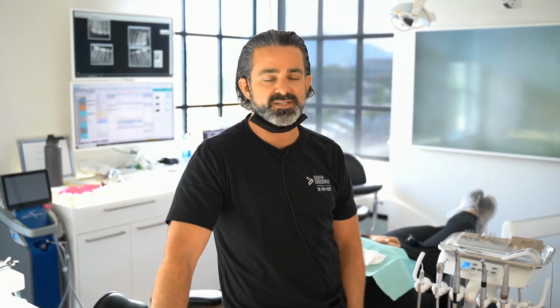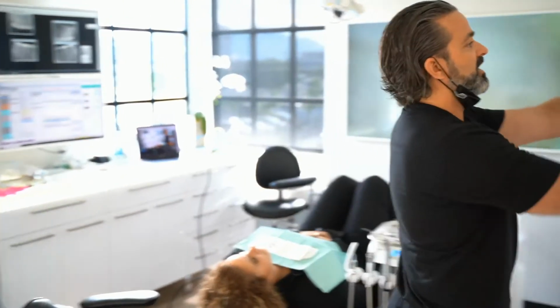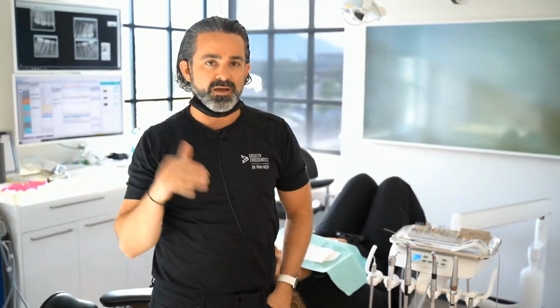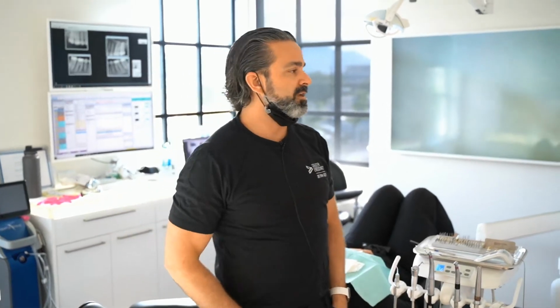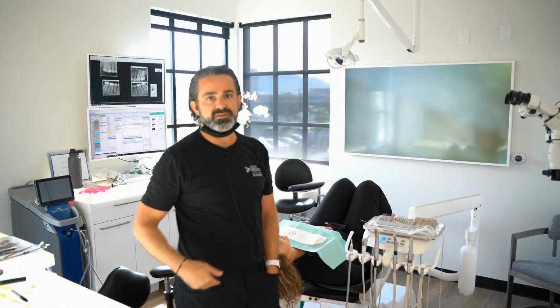I like 12 o'clock. I'm biased because I'm an endodontist, and occlusal surfaces at 12 o'clock are just anywhere in the mouth. For Class 5 dentistry or apical dentistry, these extended arms here are important, because that way I can kick my microscope and come back and look directly for more of a direct vision on any facial surface, like I said, during Class 5s or interproximal Class 2s.